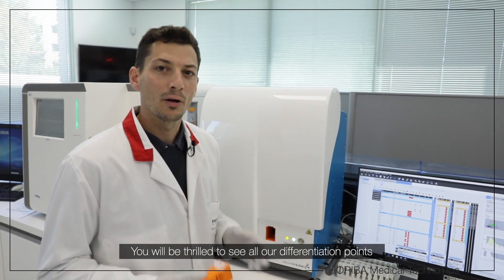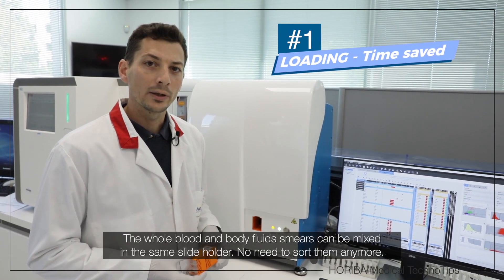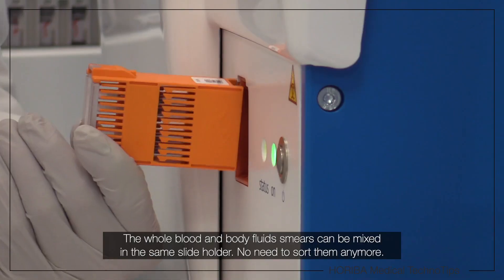You will be thrilled to see all of our differentiation points. So first, the time saved with loading. The whole blood and body fluid smears can be mixed into the same holders — no need to sort them anymore.